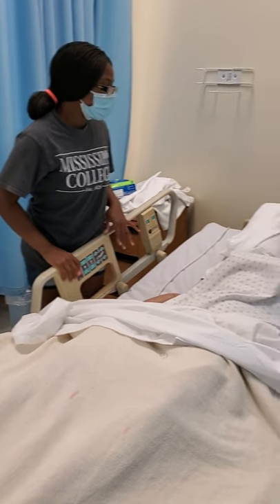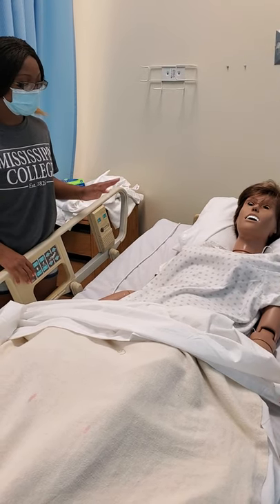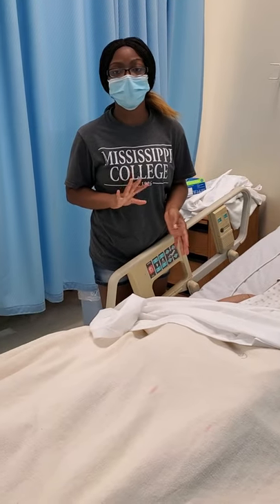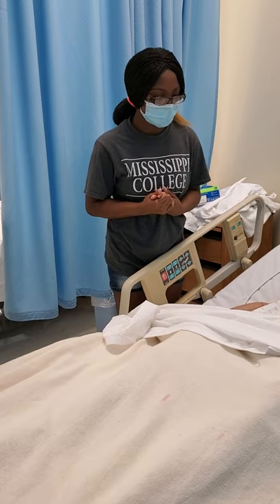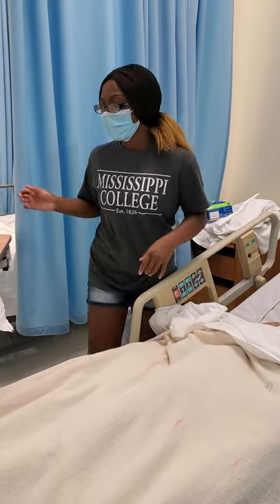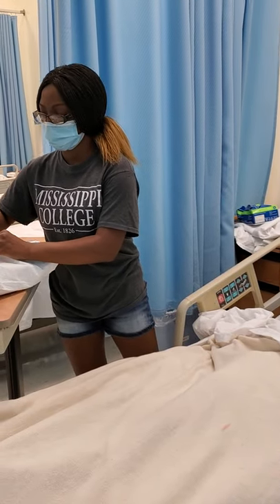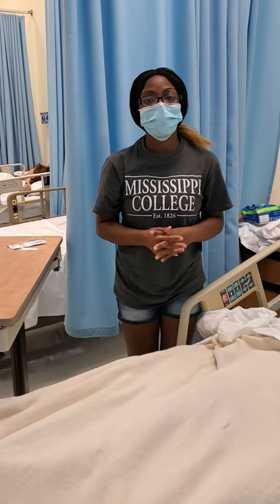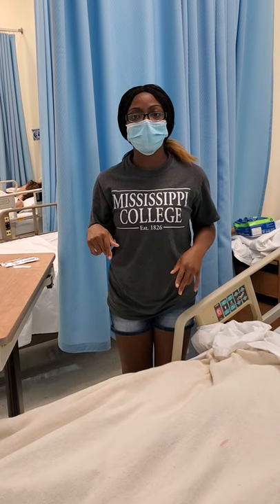Okay, Ms. Johnson, how do you feel after that procedure? Do you feel any pain? The patient stated that she feels no pain. So the procedure went successfully. All right, now I'm going to dispose of all of this. And I'm going to perform hand hygiene, and I will document accordingly the intake and output.